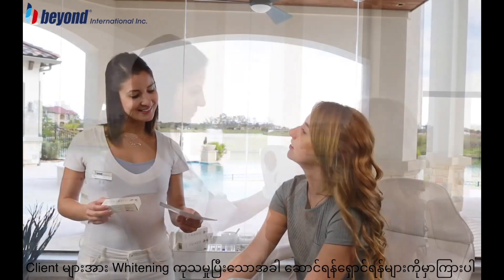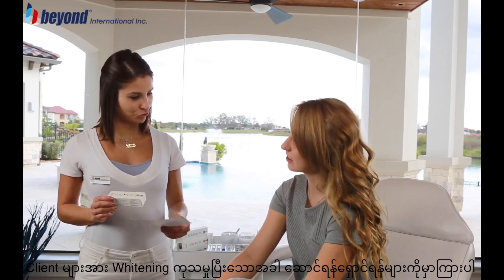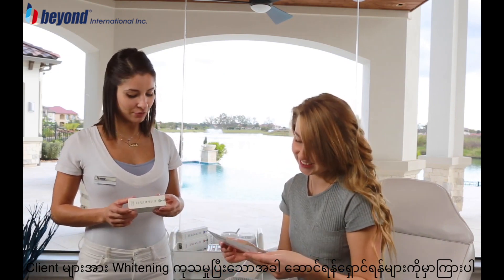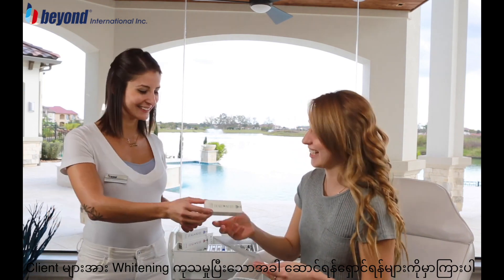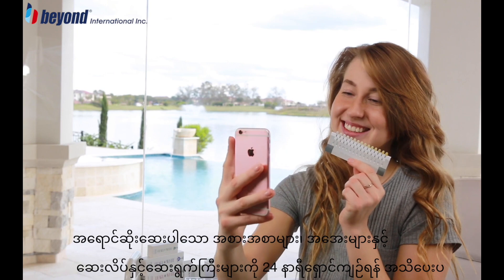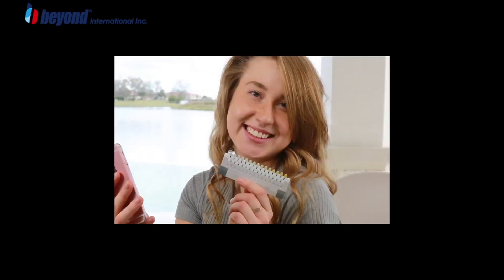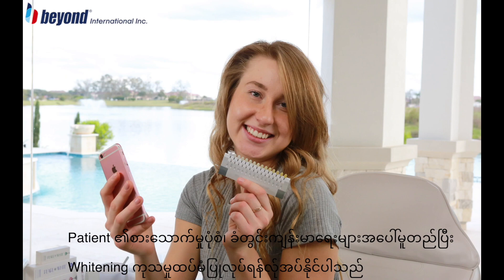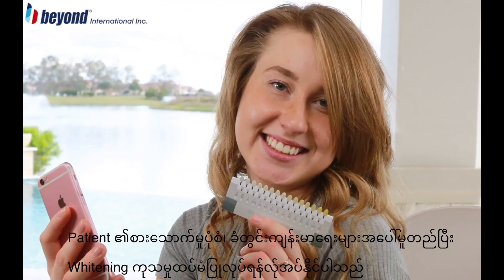Give the client a post whitening care instruction card, a trial size tube of Beyond Pearl White advanced formula whitening toothpaste, and an Osmo teeth whitening pen. Remind them that for the next 24 hours, they should avoid colored food or drinks and use of tobacco products. Depending on the client's diet, oral hygiene, and use of tobacco products, periodic touch-up treatments may be necessary to maintain their whitening results.